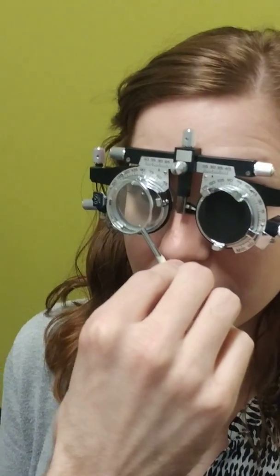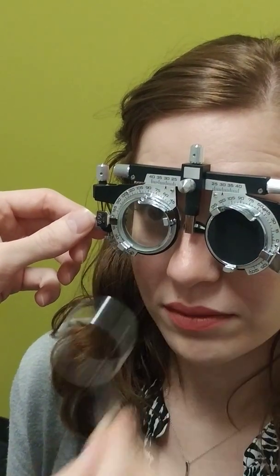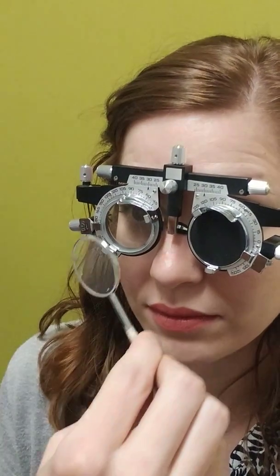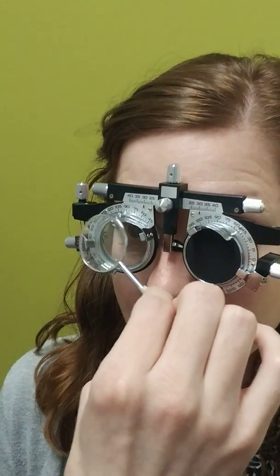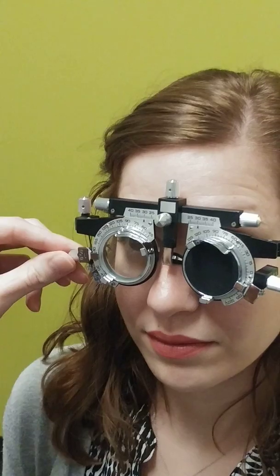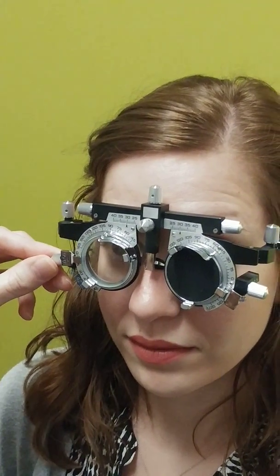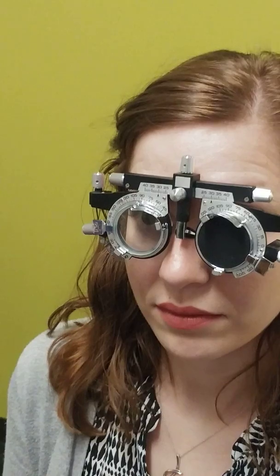More clear with three or four? She said three, which was this direction, so I rotate 15 degrees that way. How about five or six? She said six, in the other direction. Then seven or eight or about the same? She said seven — still the same direction — so I rotate again. Nine or ten or pretty close? She said nine is a little better. At this point she's already kicked me past 135, so she's really at about 136 degrees. I would stop here and switch back to power.